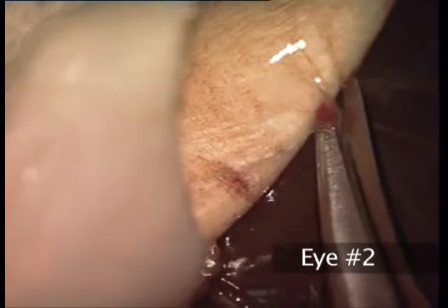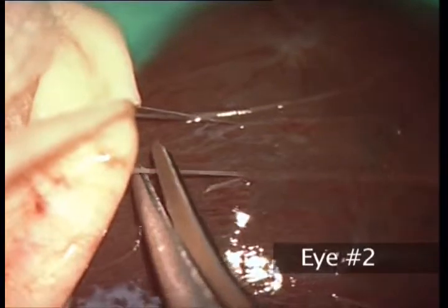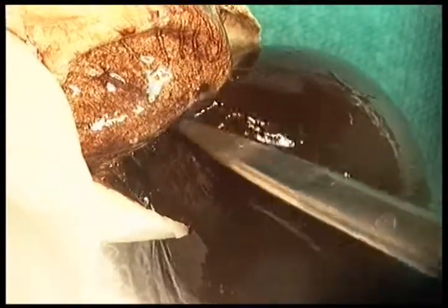The vortex veins are cut. Then the short ciliary nerves. The detachment of the sclera from the choroid continues with the help of the scissors.